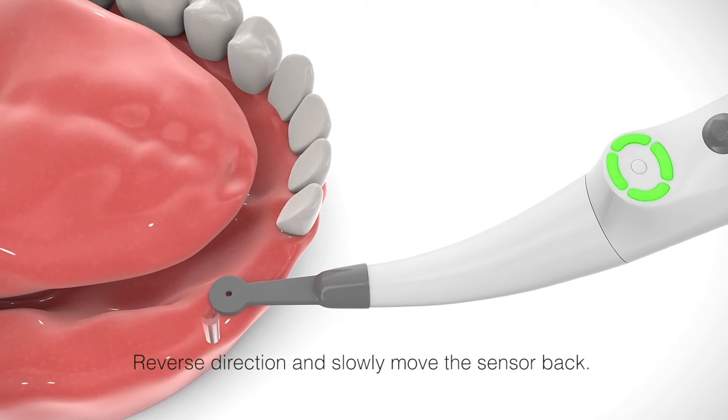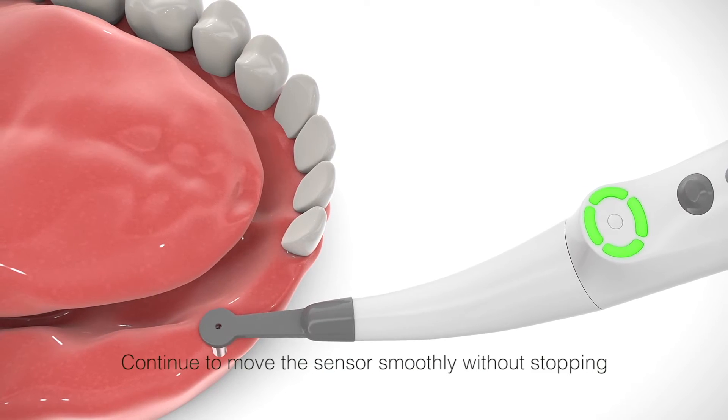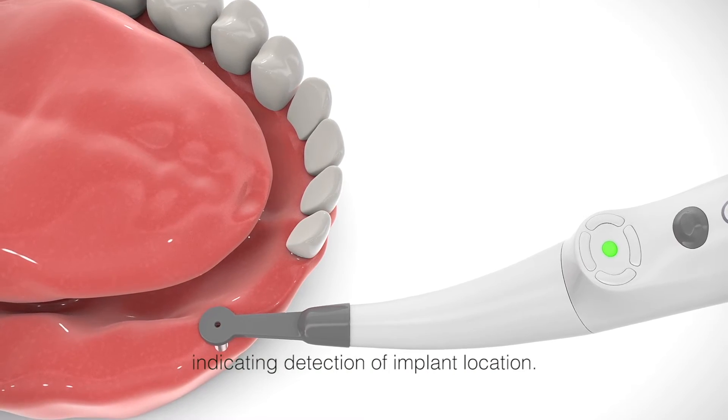Reverse direction and slowly move the sensor back. The four segments turn green again. Continue to move the sensor smoothly without stopping until the center dot turns green, indicating detection of the implant location.